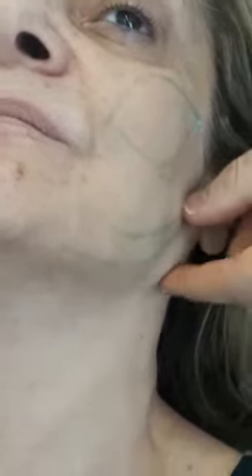You can maybe make some chin contour with some injectables here in order to stress the tissue, project the line a bit and obtain a nice tension over here. But don't go for threads here, because you're going to experience a dimple, and it's going to be problematic for you and for your patient. And that thread is 50 centimeters long. Even removing it is something important. So respect the indication and the points here.